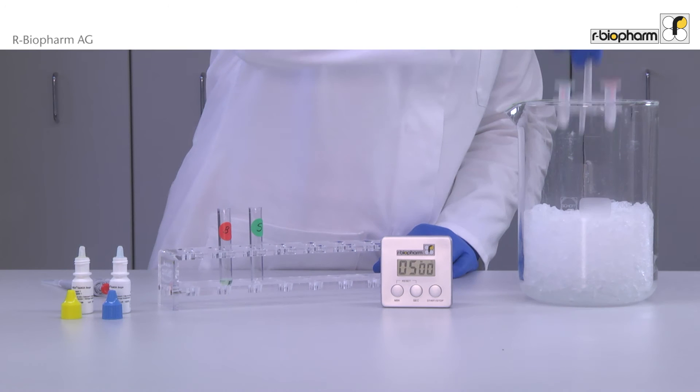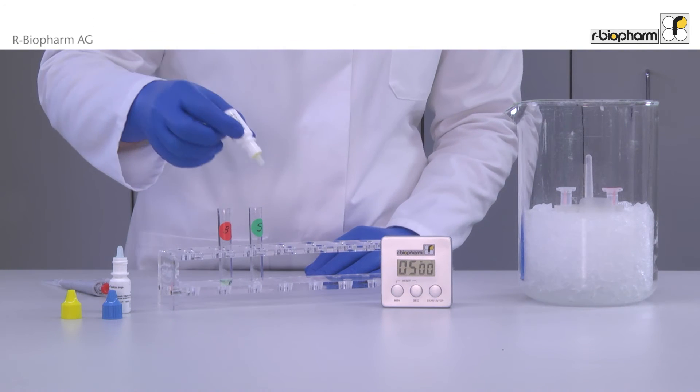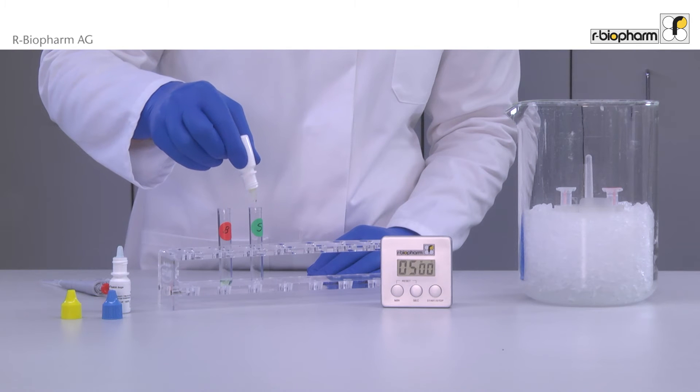The vials are cooled down to 25 degrees Celsius. Then five drops of each conjugate are added to new five milliliter tubes.